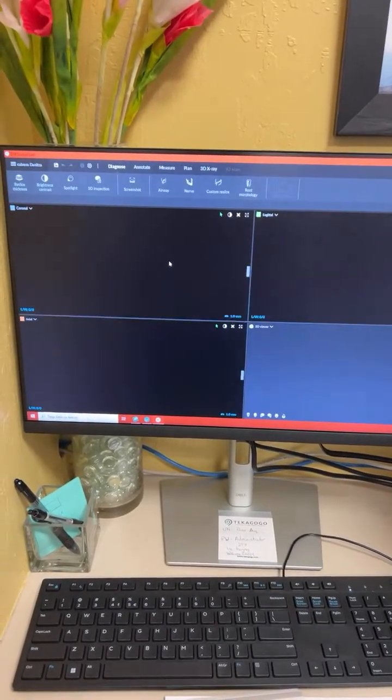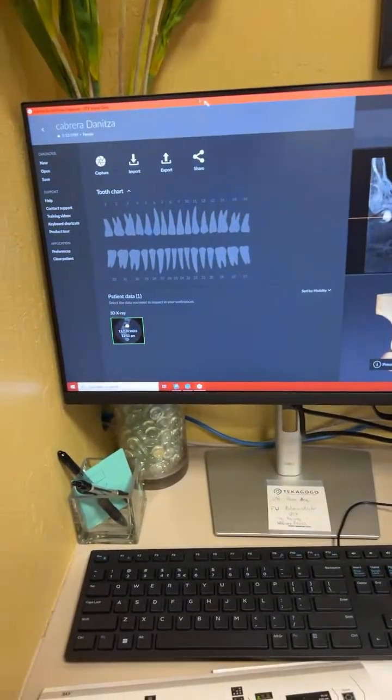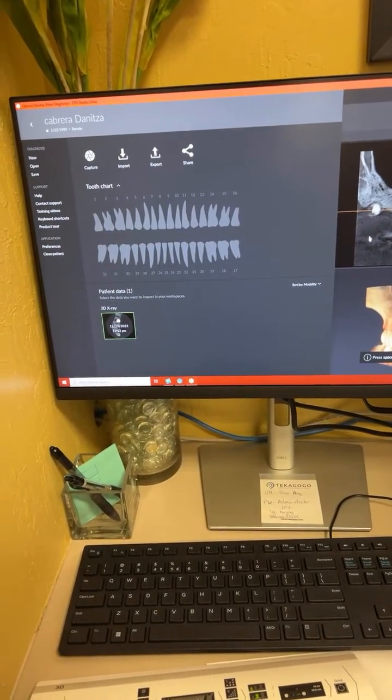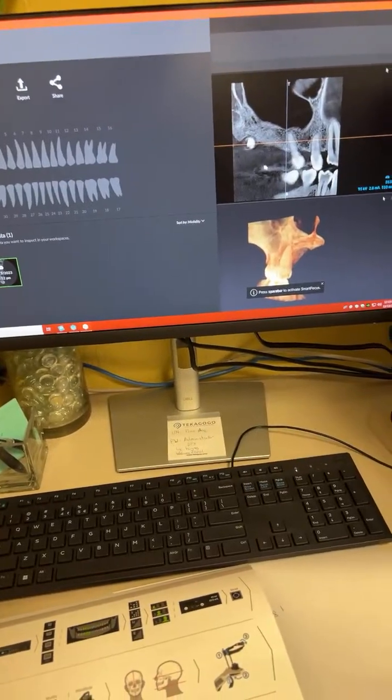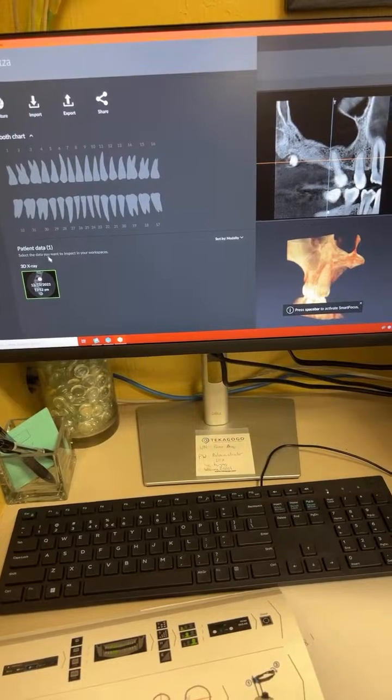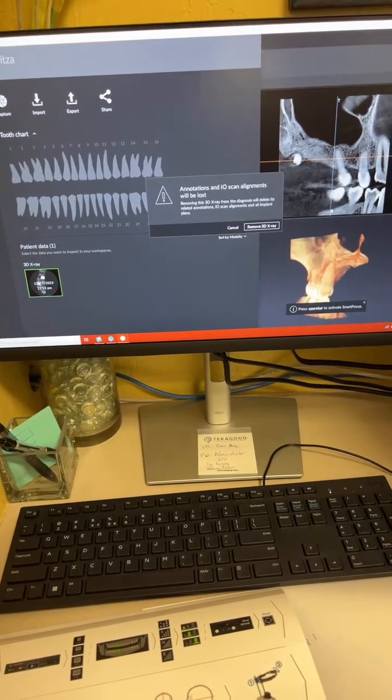I have a question. Sometimes the patients have piercings, like nose piercings or tongue piercings. Would that affect the scan? It will. You should have them remove that, because you can get some artifacts off of the metal. Yeah, they should remove that.